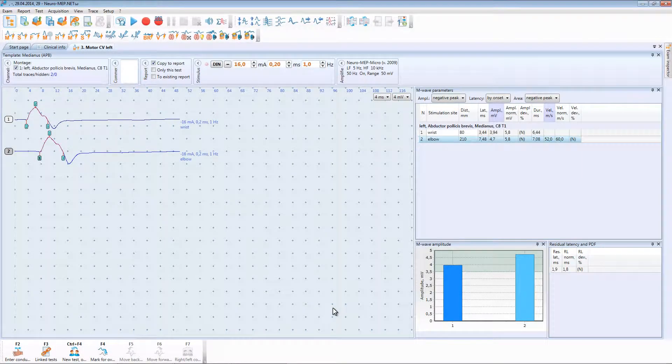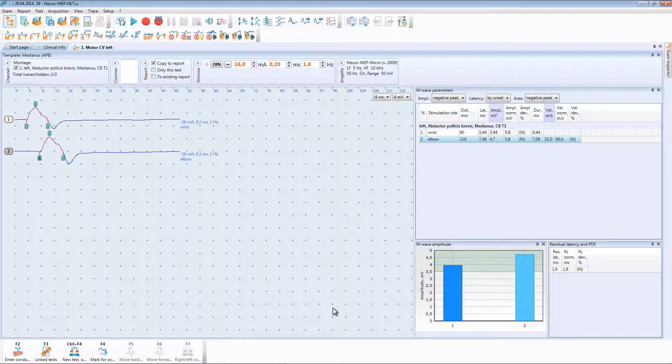Today we continue motor fiber conduction study. Earlier we performed medianus nerve study using motor conduction velocity technique. This technique allows performing conduction study only by distal parts of the body.